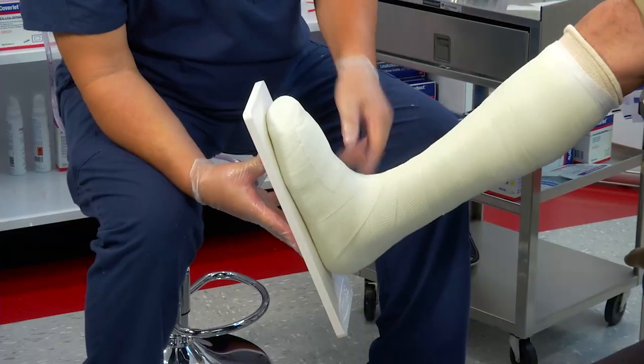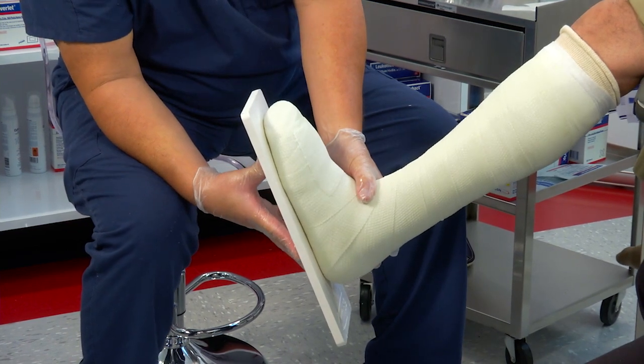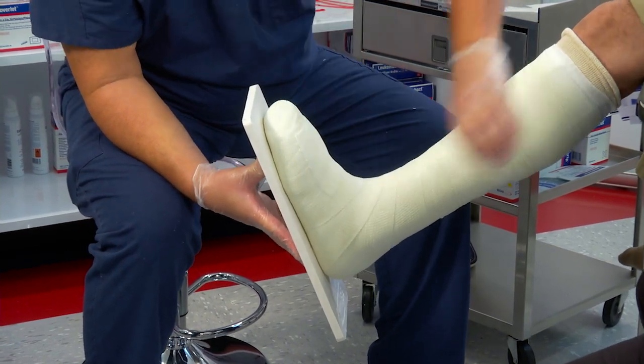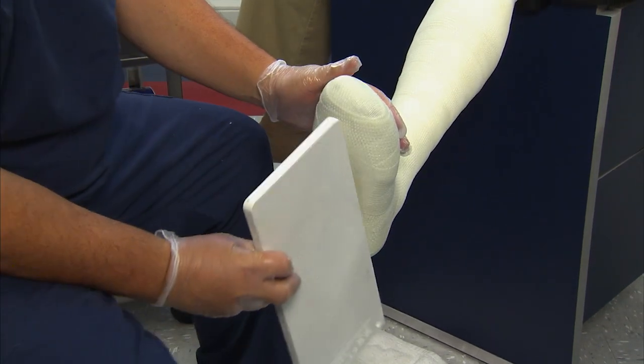I've achieved the flat surface between the fifth and first metatarsal heads and the calcaneus — that's the flat surface. I'm going to take this off, and you'll see the flat surface that we created, just like that.